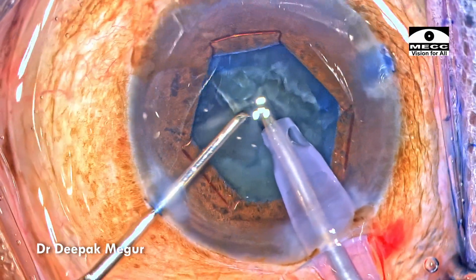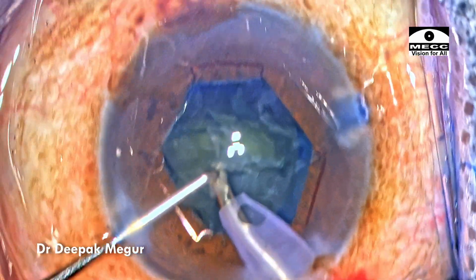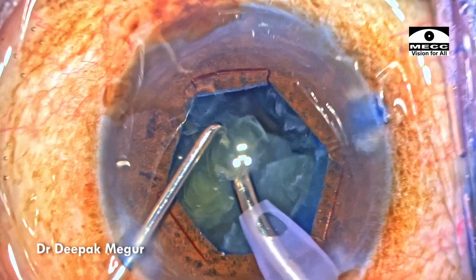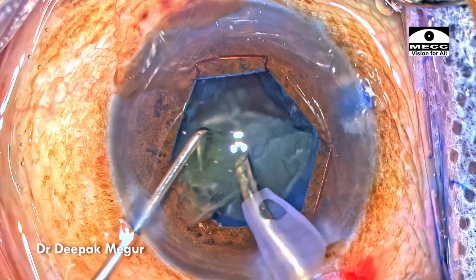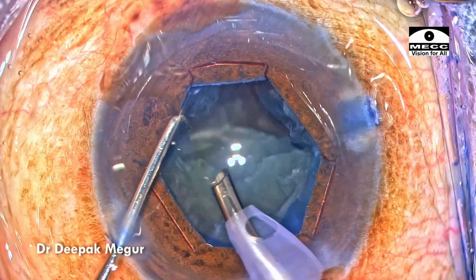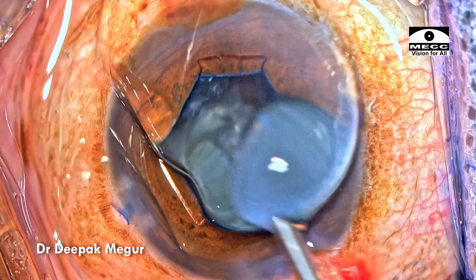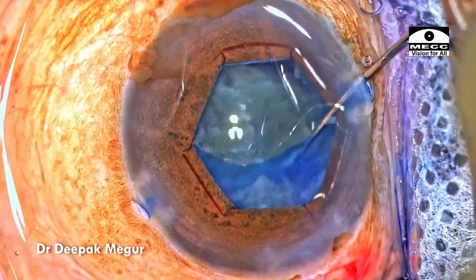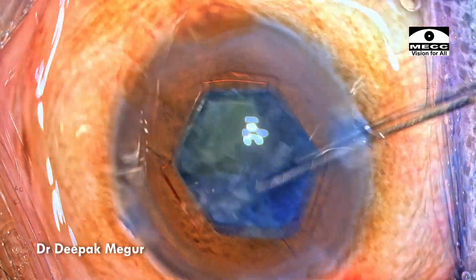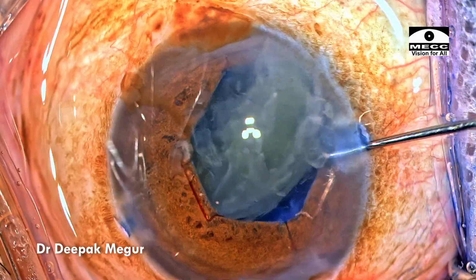Carefully and very slowly, each of these fragments is gently manipulated out of the bag into the antechamber and then aspirated. Again, as the fragments are being emulsified, it's very clear to see the bag being very wobbly and dancing around. OVD is introduced again to pressurize the globe a little bit. So I'm avoiding nucleus rotation within the bag. Instead, I'm just using my lens hook to manipulate this soft heminucleus out of the bag into the antechamber for it to be aspirated.